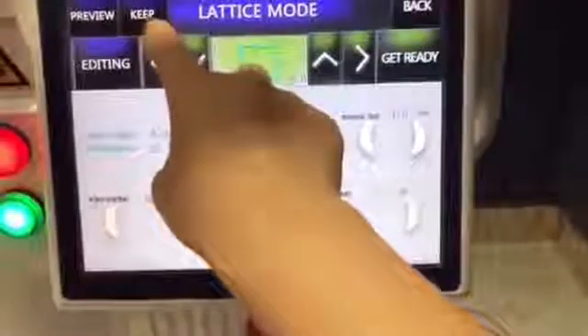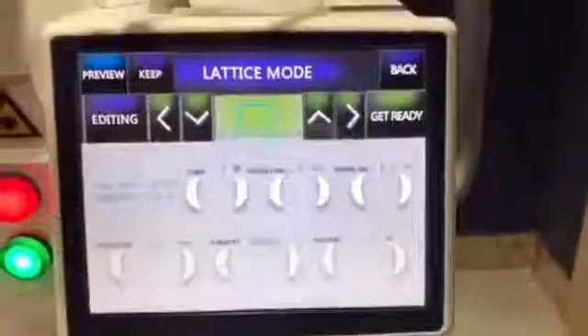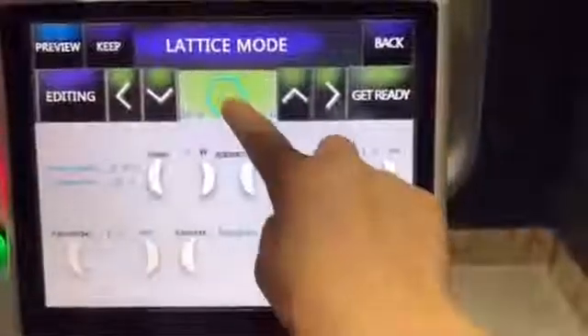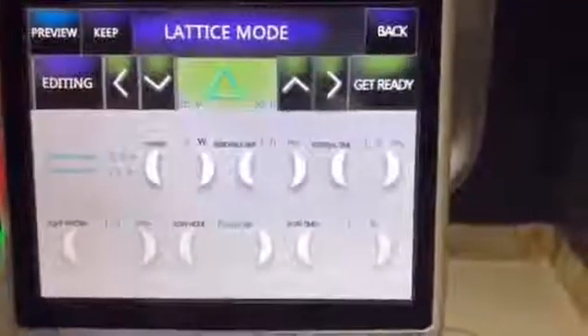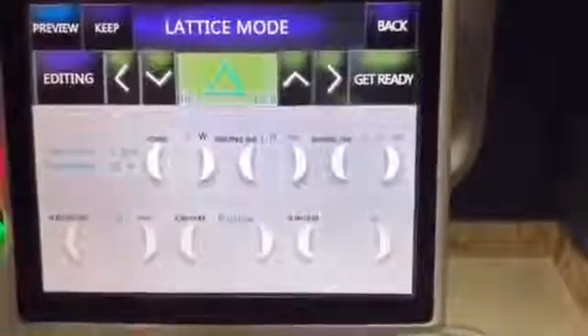Here you can save the parameters for next time. You can also see and choose the shape — different shapes are available. You can adjust the size by increasing or decreasing. Use the foot pedal to operate. You can increase the size according to the client's needs.